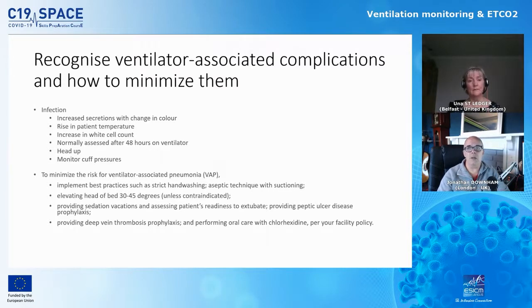Sometimes there can be some gastric reflux because the patient's very sick. It's one of the reasons we give them the drugs to try and reduce the gastric aspirations. And sometimes that gastric reflux can come up and go back down the airway. The balloon can help minimize this, but the balloon protecting the airway does have little microfolds in it where some of those secretions can go down and cause the patient to develop a ventilator-acquired pneumonia. So always try and sit your patient up a little bit.